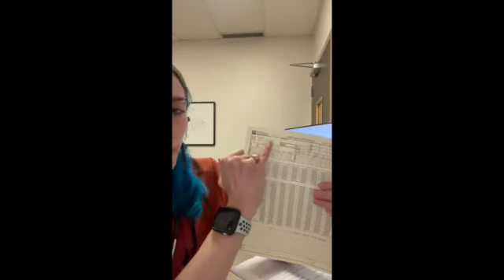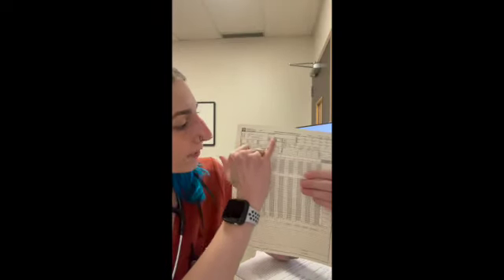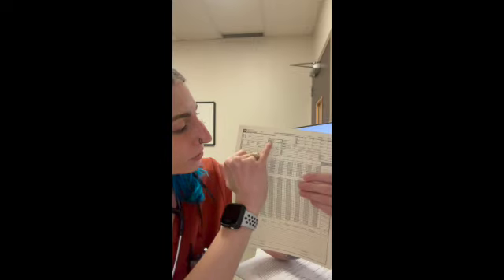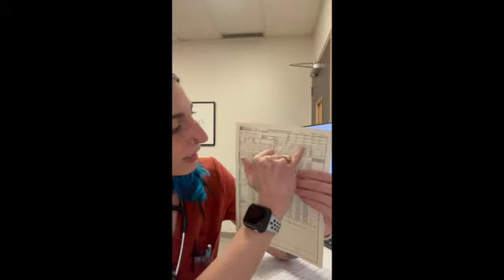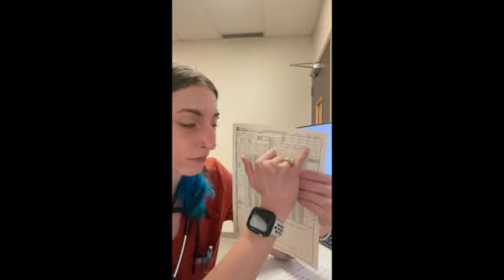So here at the top, we have our case information. We have our procedure that will be performed, our patient weight, the ASA status, any of the monitoring that will be required for this patient. We have a blood work section for the basic blood work results from that morning.